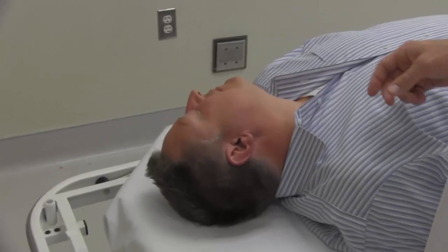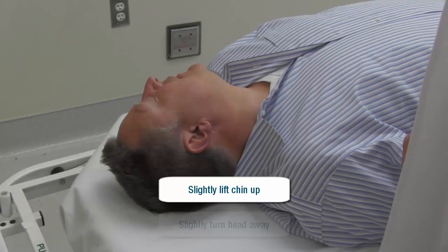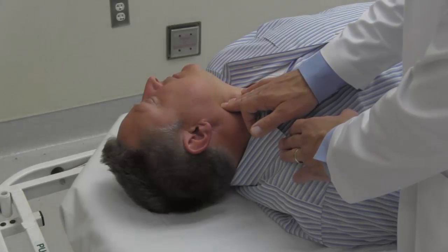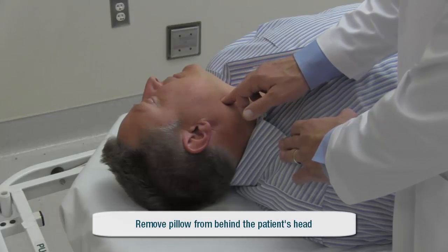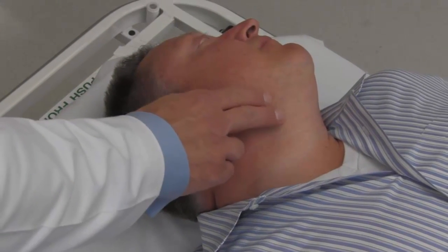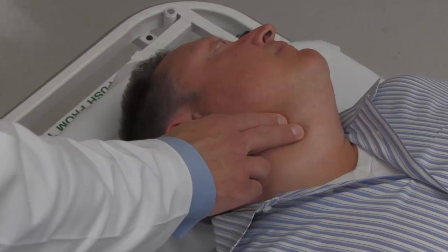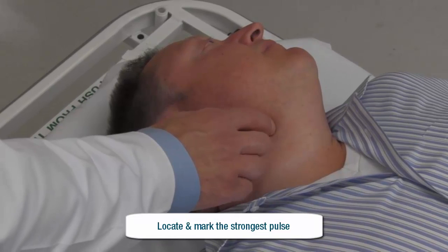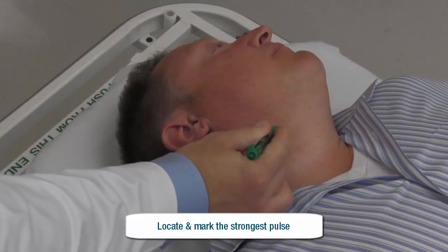To assist in identifying the carotid pulse location, it may be helpful to have the patient extend his neck by lifting his chin and slightly rotating away from the artery being palpated. If needed, a rolled-up towel may be placed under the patient's neck for support; however, it is ideal to remove any pillow from behind the patient's head. Begin by palpating the carotid artery just below the patient's jaw with multiple fingers. Continue to reposition the fingers until a carotid pulse is located. Once located, attempt to pinpoint the exact location of maximal pulsation by transitioning to palpating with a single fingertip. Make a mark on the patient's skin at this point.